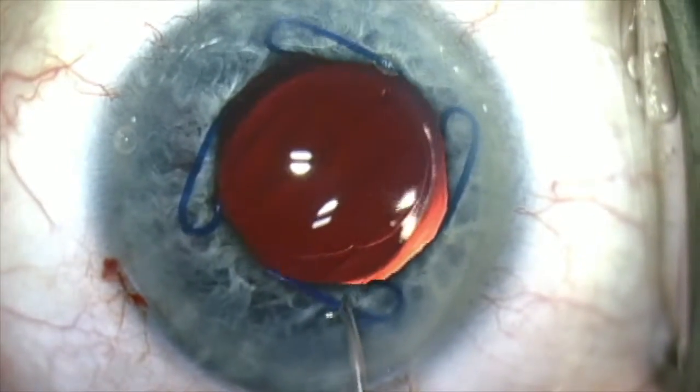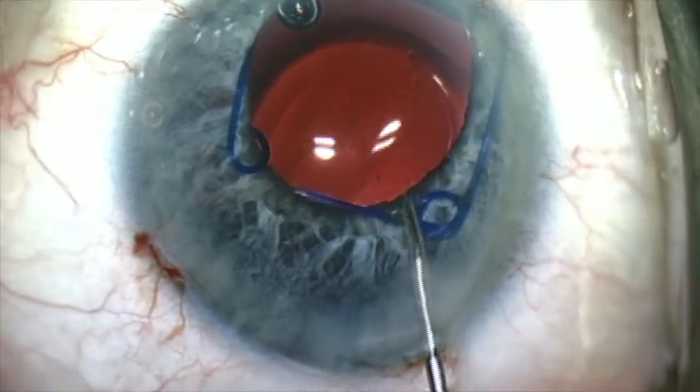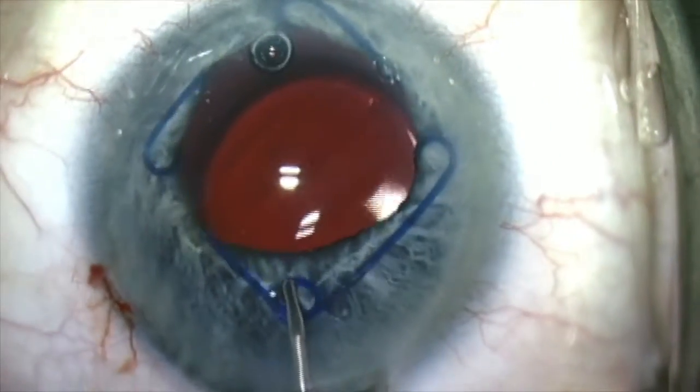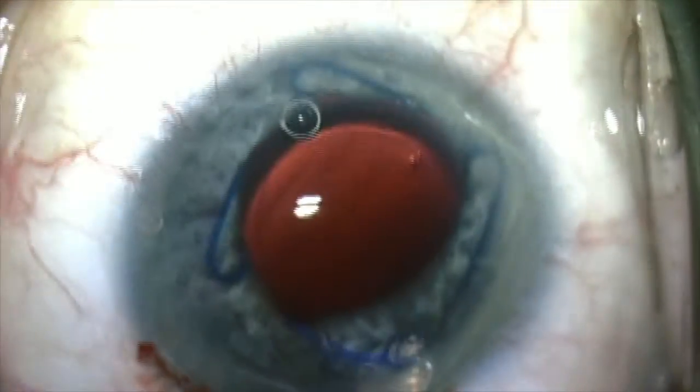Then I rotate the ring, either clockwise or counterclockwise, to get it away from the pathway of insertion of my phaco handpiece.